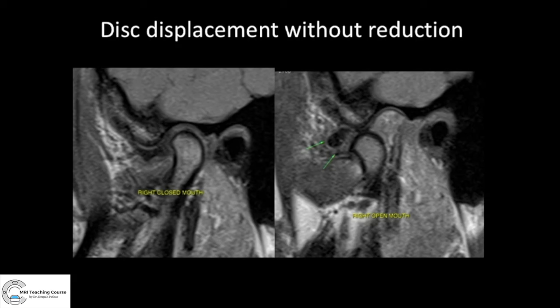Another example: this is the disc, and you can see it looks degenerated — it doesn't appear as dark as we saw earlier, but the shape still identifies it as the disc, and there is nothing in the normal disc position. This disc is displaced anteriorly, and on open mouth, the mandibular condyle moves anteriorly but the disc remains anterior and the patient is not able to fully open the mouth. This is disc displacement without reduction.